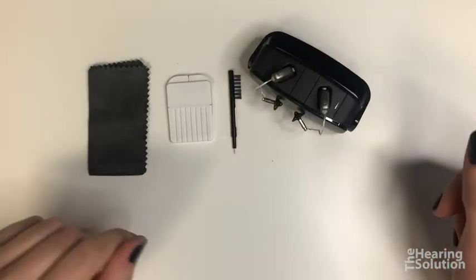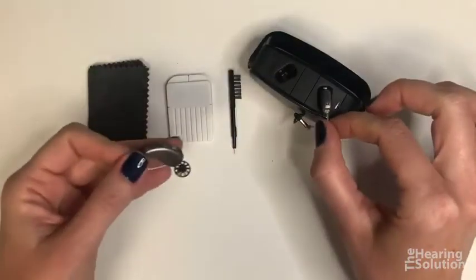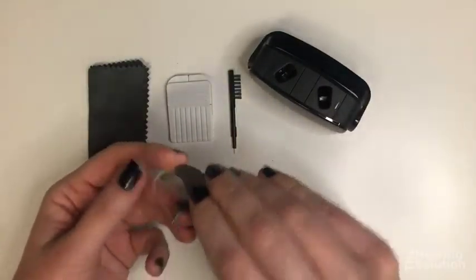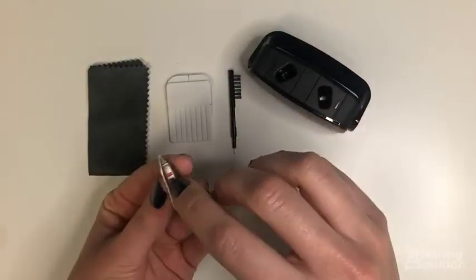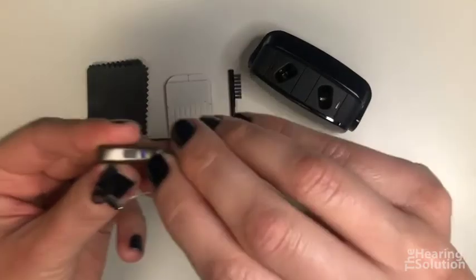I'd like to show you how to clean your Widex Moment hearing aids. What you'll do is take them out of the charger or off your ears. The red is for your right ear and the blue is for your left ear.